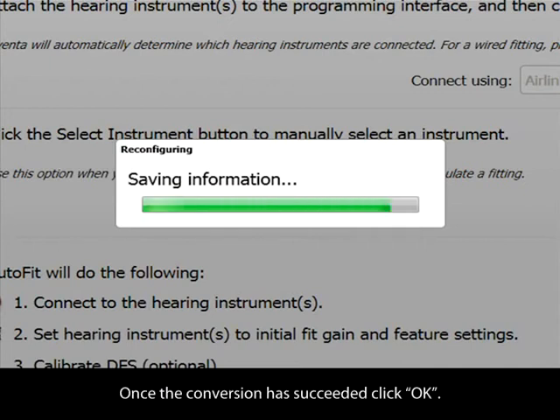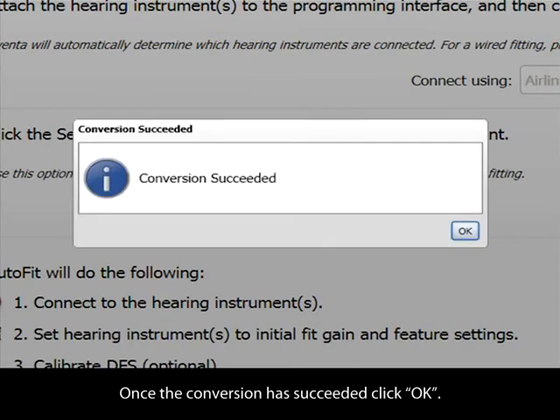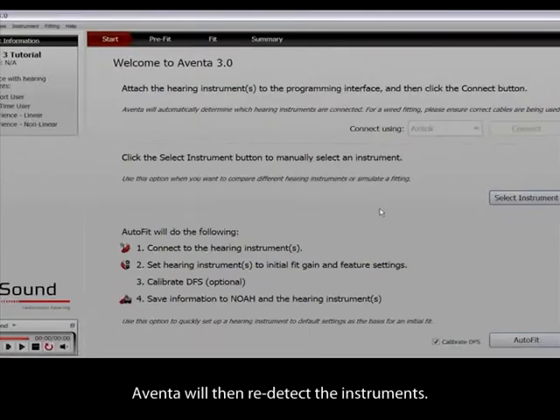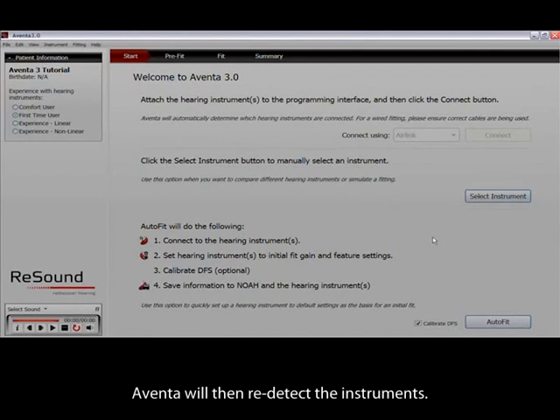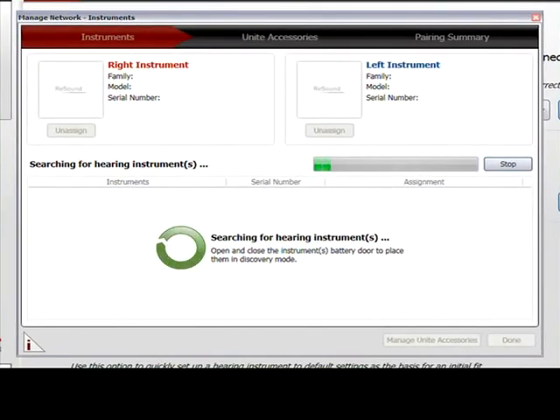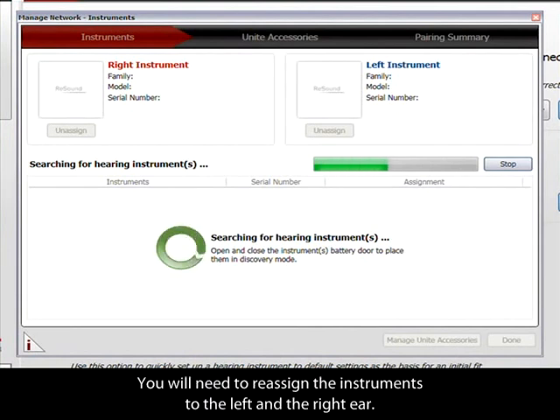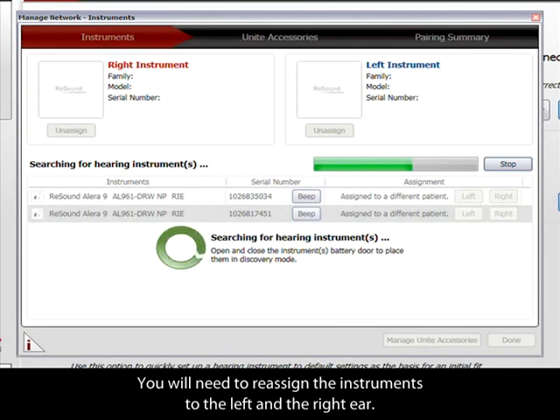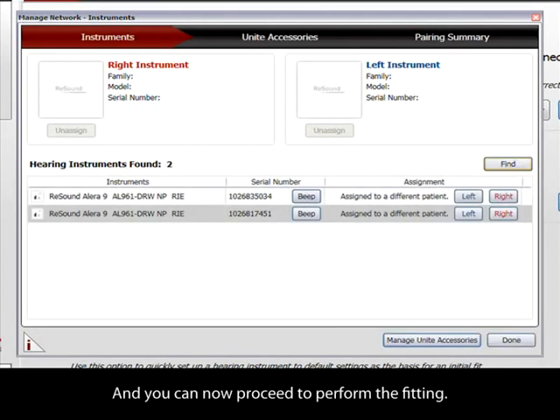Once the conversion has succeeded, click OK. Aventa will then re-detect the instruments. You will need to re-assign the instruments to the left and the right ear, and you can now proceed to perform the fitting.